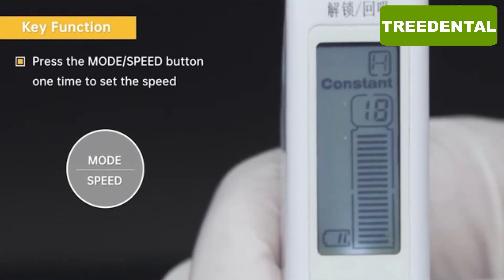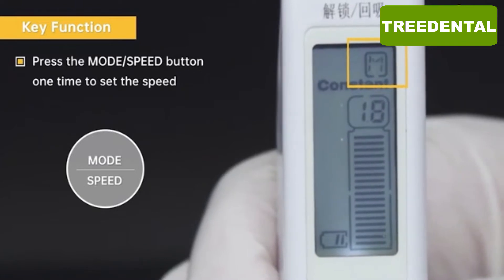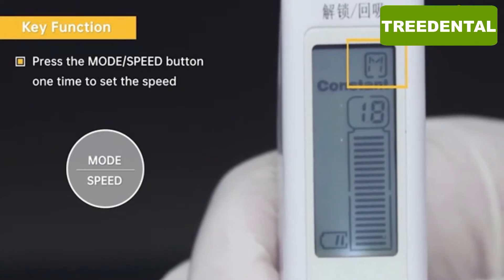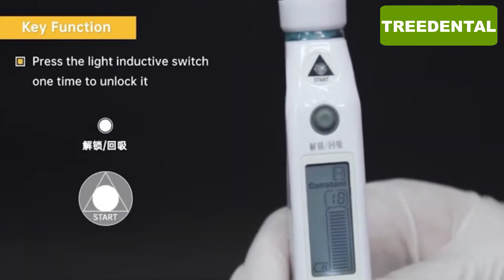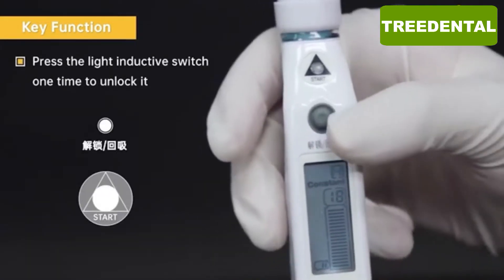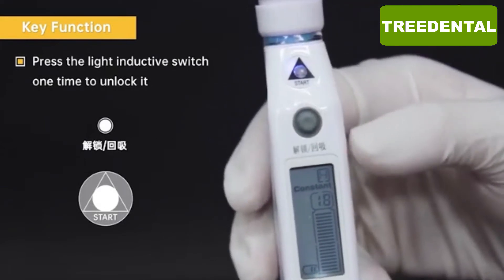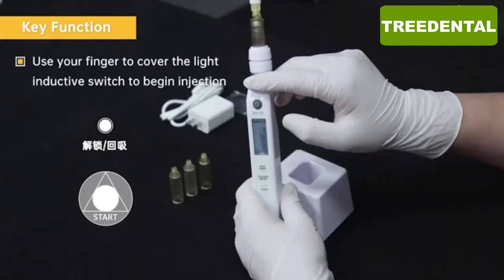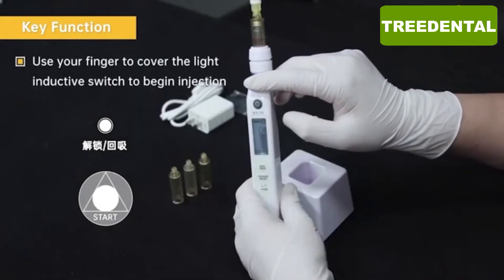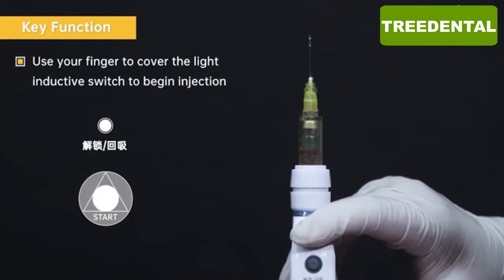Press the mode speed button one time to set the speed. Press the light inductive switch one time to unlock it. Use your finger to cover the light inductive switch to begin injection.